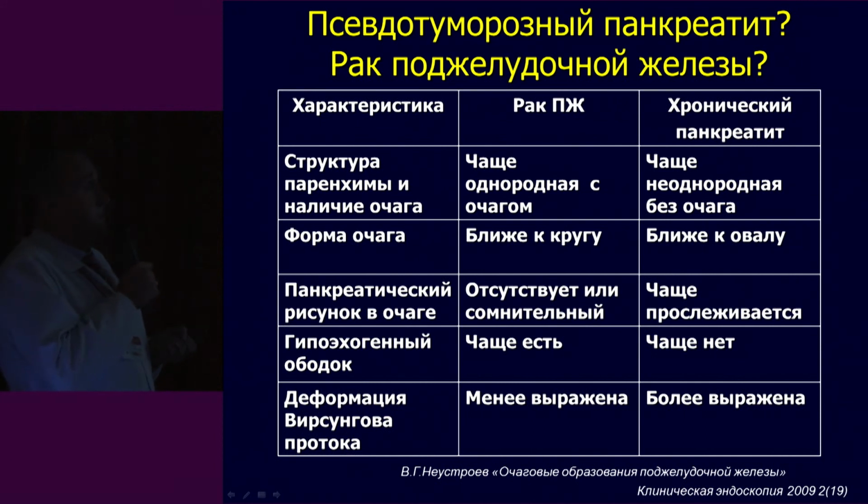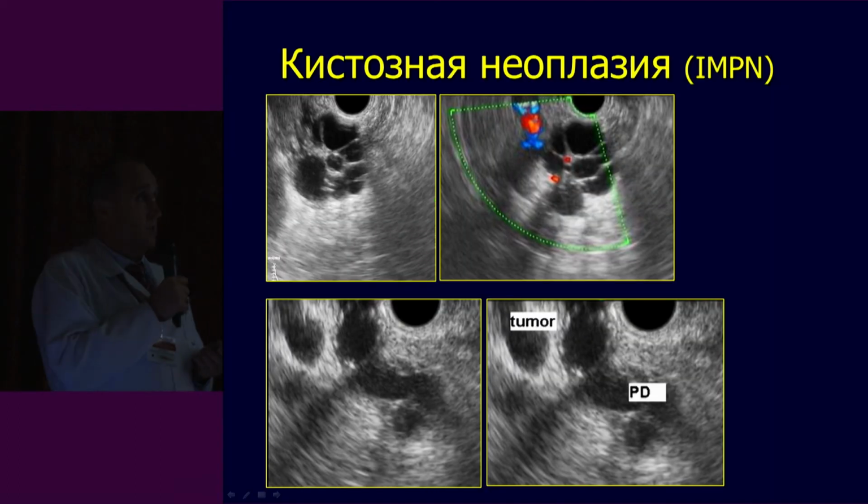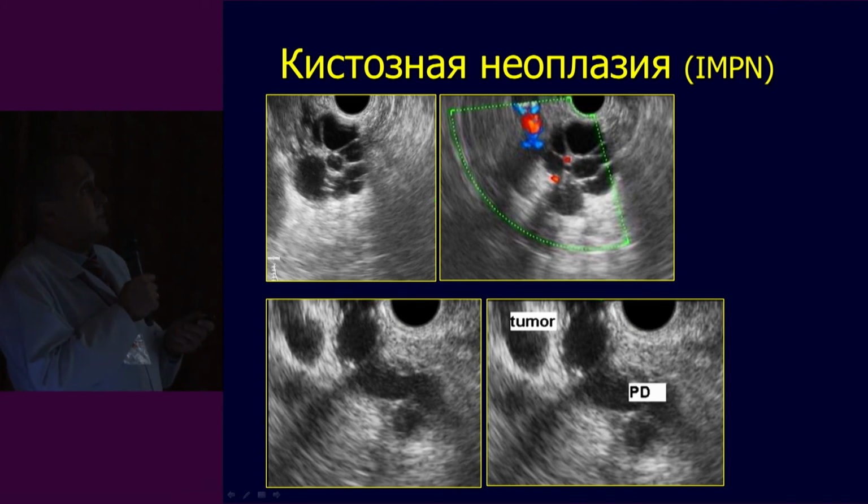Diagnostics is something that you are going to discuss further on. Evgeny Solonitsyn will talk about this in detail. Solid malformations. Why do we need EUS here? In order to differentiate, to stage, and to get histological verification further on in order to determine the treatment strategies.